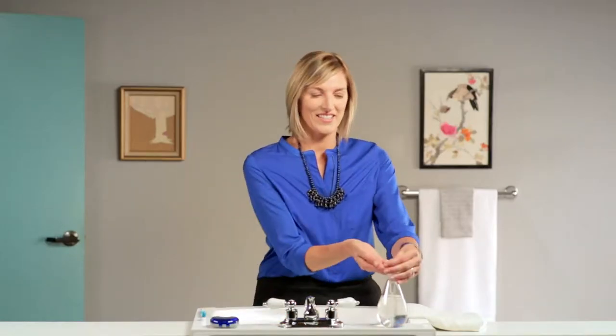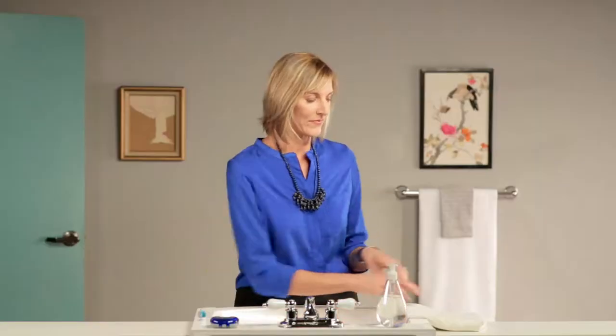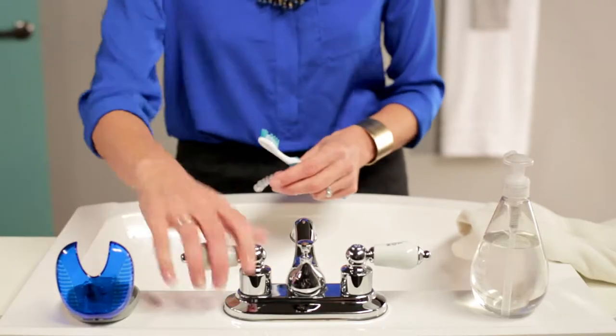Remember to clean your aligners before wearing them, wash your hands with soap and water, and handle only one aligner at a time. Clean both the inside and the outside of each aligner.